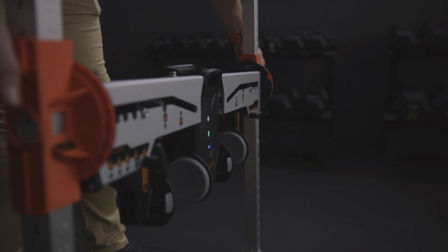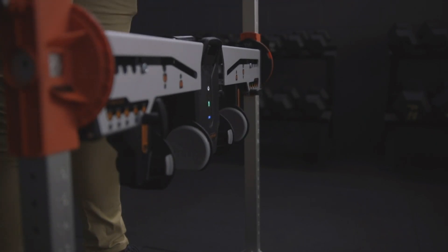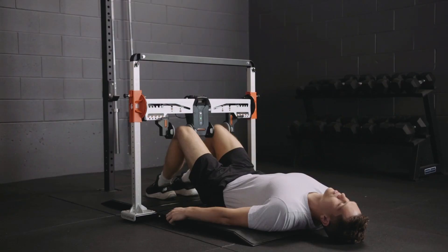The knee angle will determine the bar height as well as the athlete's foot position. Thereafter, by logging this bar height — either in the system if it allows it, or on your computer or pen and paper — you can then automatically set that athlete's bar height and you don't necessarily need to use the goniometer each time. You're aiming for the athlete to be able to constantly push out or squeeze in on the knee pads, so you want the femoral condyles of the knee to be placed centrally within those pads.